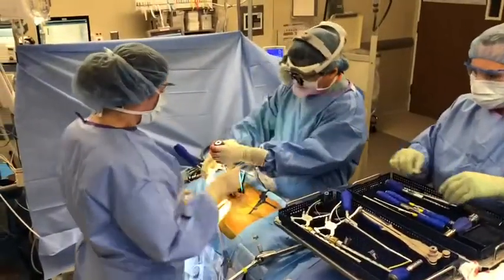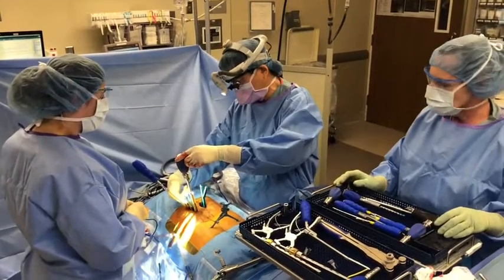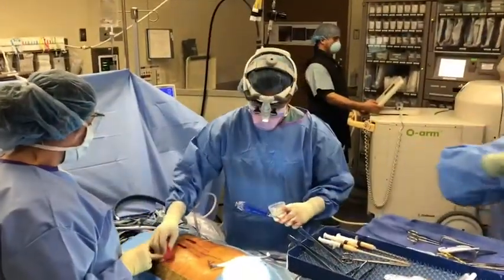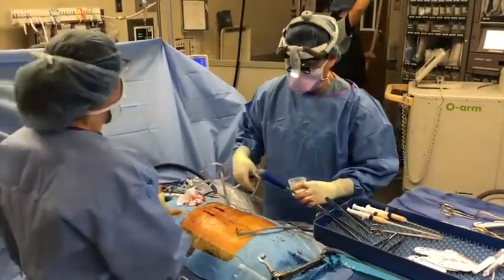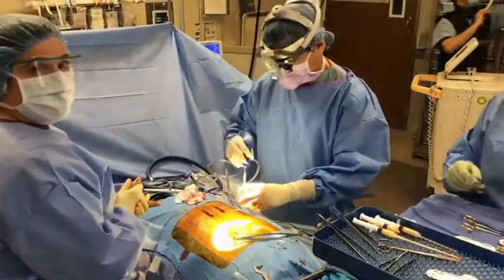I have got the rod down. I passed it through these sleeves and now I'm putting the nut down the rod sleeve guide. The case went beautifully. I was able to do it through two small incisions. We did not lose that much blood. We got a very good reconstruction. All done now.